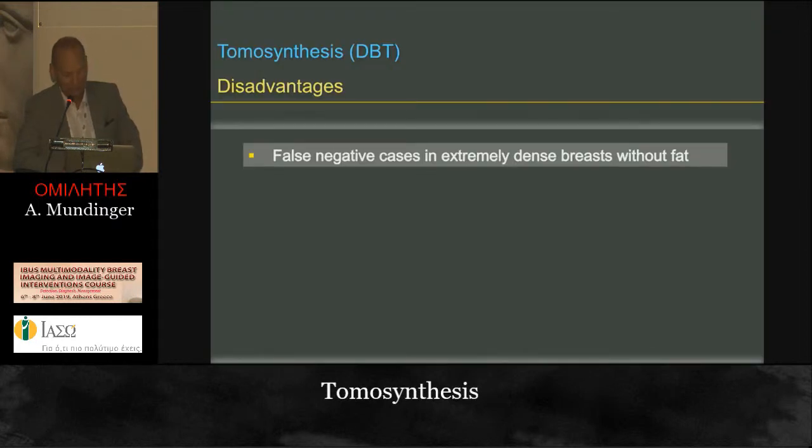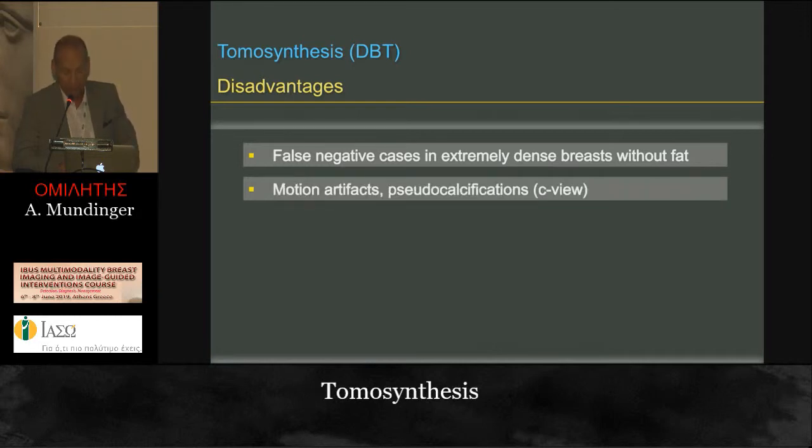What about the disadvantages? We have false negative cases, particularly in extremely dense breast without fat, and then you don't have a contrast to show the architectural distortion or the changes. We have sometimes motion artifacts and pseudo-calcifications, particularly due to reconstruction problems.